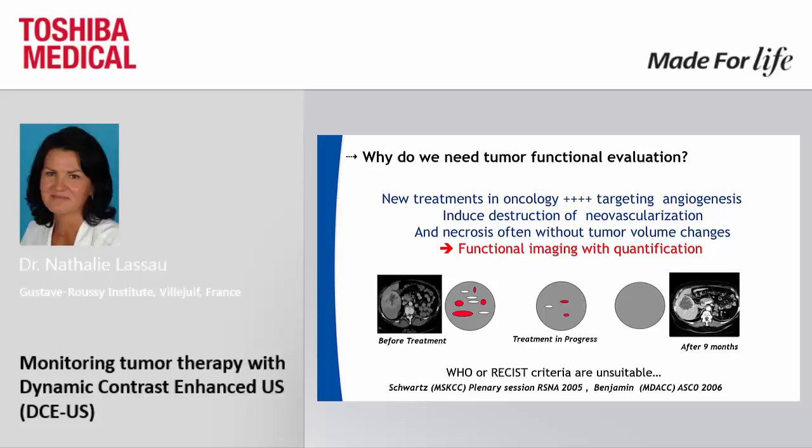vascularization. And the goal of the functional imaging is to try to quantify this destruction and to link this modification to the outcome of the patient and to the overall survival. And the FDA asked us to demonstrate this level of validation for the biomarker.